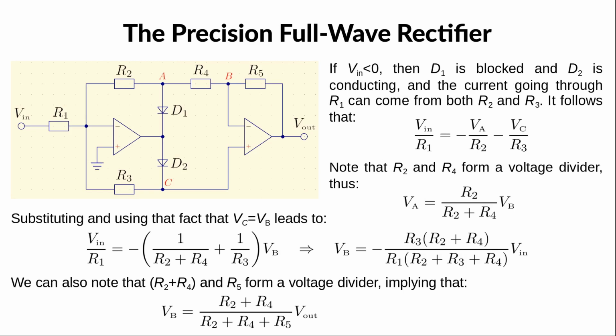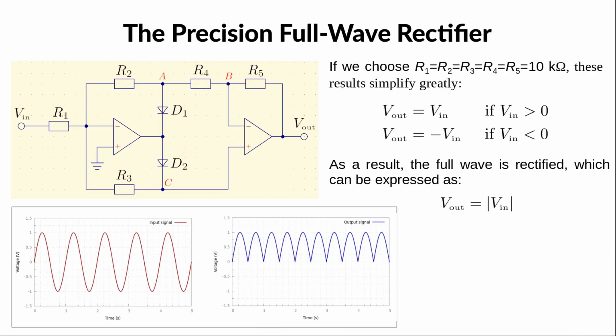In a similar way, we can also notice that R2 plus R4 and R5 form a voltage divider, which is true only because the diode D1 is blocked. This gives us a second equation for Vb. So we can eliminate Vb, and this way we obtain the output potential as a function of the input potential. Now, if we choose the same value for the 5 resistors, then everything simplifies and the conclusion is that Vout is just equal to the absolute value of Vin. As a result, the signal is fully rectified as illustrated on the figures.